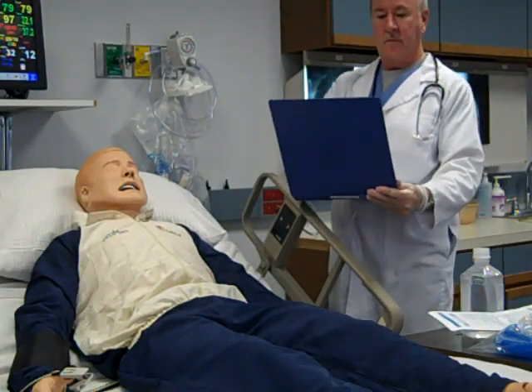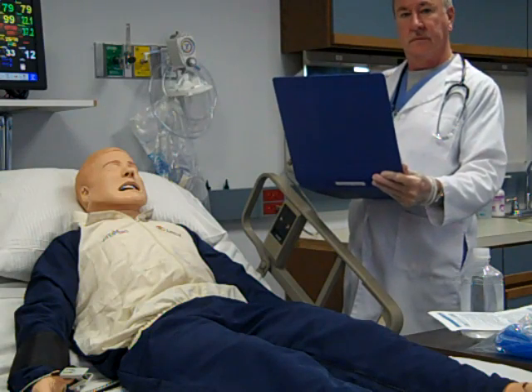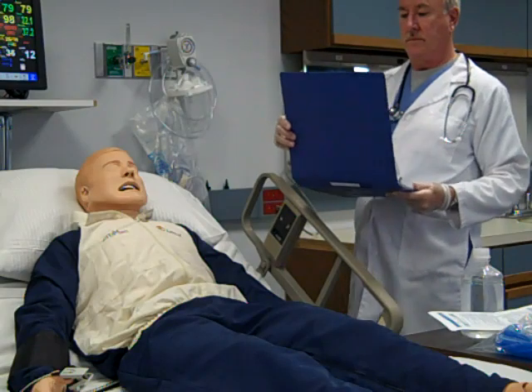Check the patient chart for the current physician's order. This should include FIO2 and method of delivery or general titration percentage.